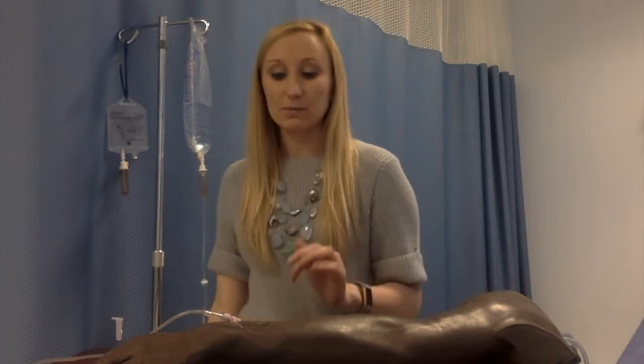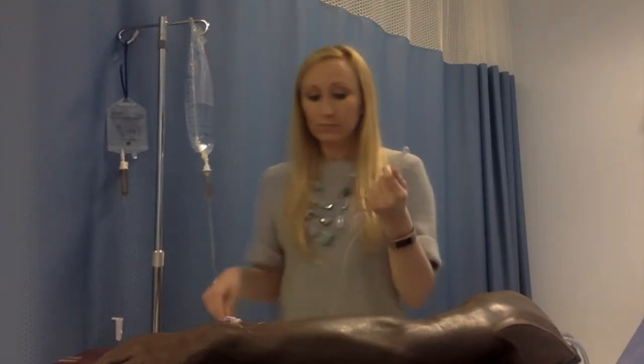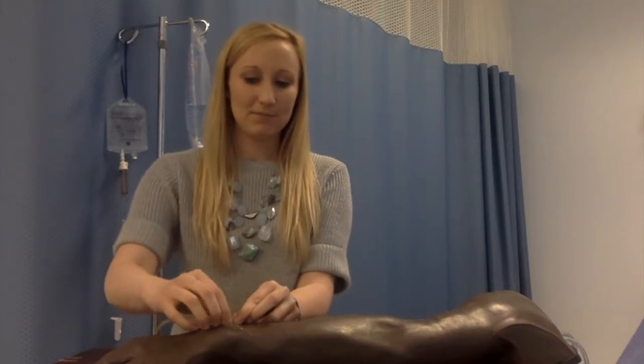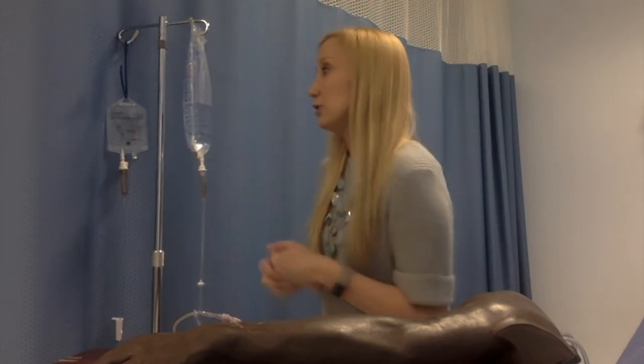I should have explained, before you connect the tubing to the patient, you always want to make sure you prime your line. So that means getting all the air out of the line. You do that mainly just by hanging the end over a trash can or a sink and just letting some of the solution go through and get all the air out of the line. Then you'll connect it to your patient. You can allow it to flow in. You can unclamp it and allow it to flow as quickly or as slowly as you would like. So that is your primary tubing.